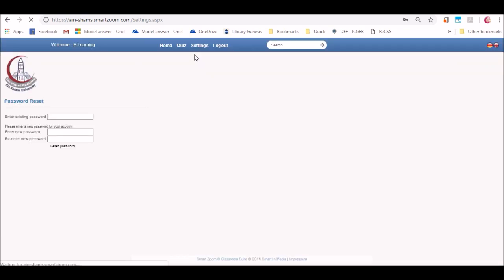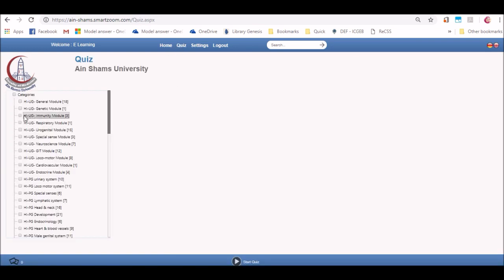In the top bar, you will find the settings button in which you can change your password. Also in the top bar, you will find a quiz button that enables you to test yourself in any of the given categories.